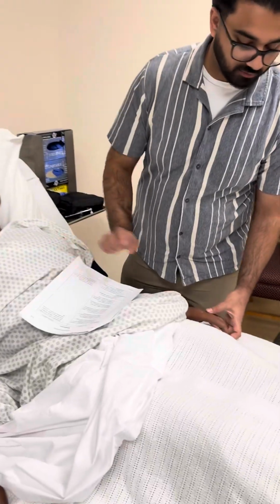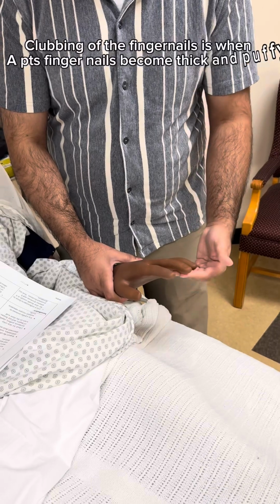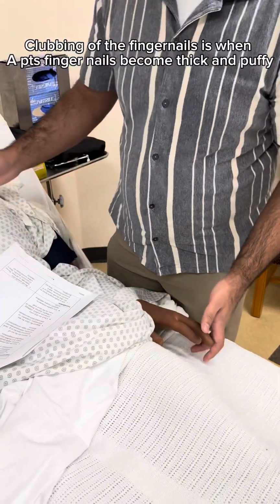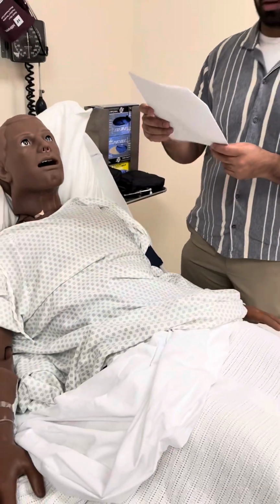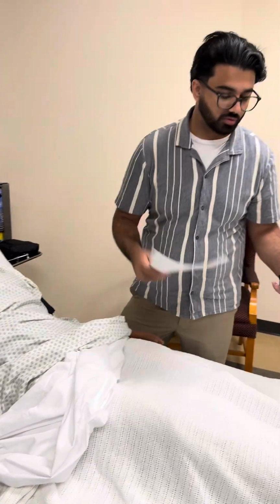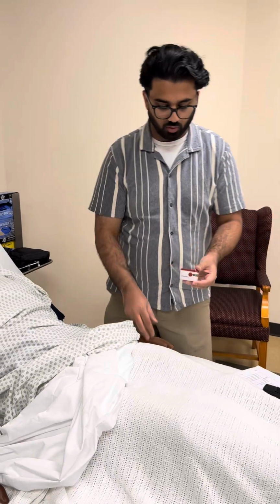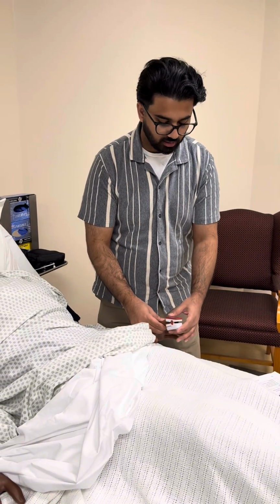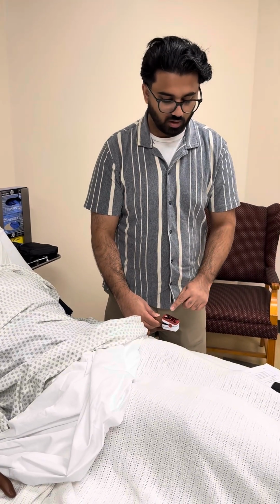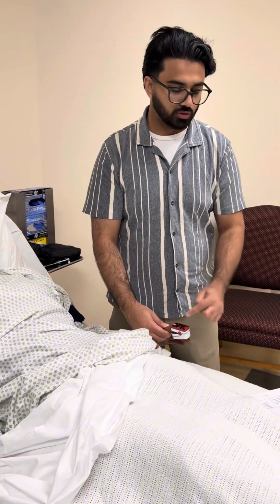Next, we will be looking at their fingers. I'm looking for any clubbing of the fingers. I'm looking for any lesions or scars on the chest wall, which I did when I was looking at the chest. Now I'm looking for their pulse oximetry levels. So I'm going to pull out my pulse oximeter and apply it to the finger that is assigned to our simulation person. For demonstration purposes, I cannot show the numbers, but you would be looking for 95% to 100%, and it will show their pulse as well.